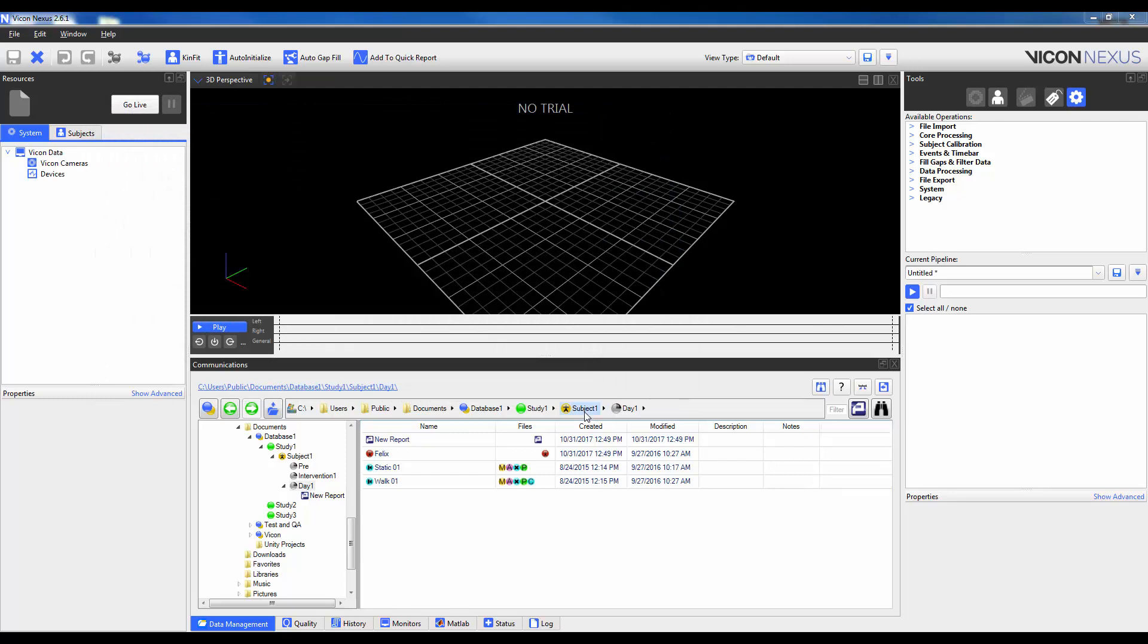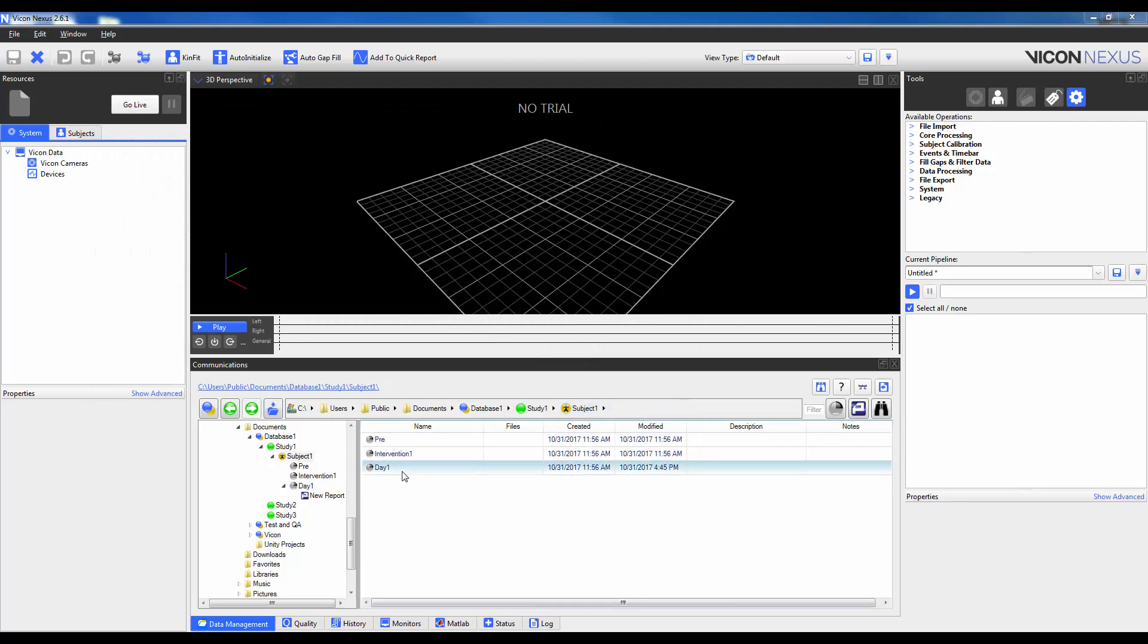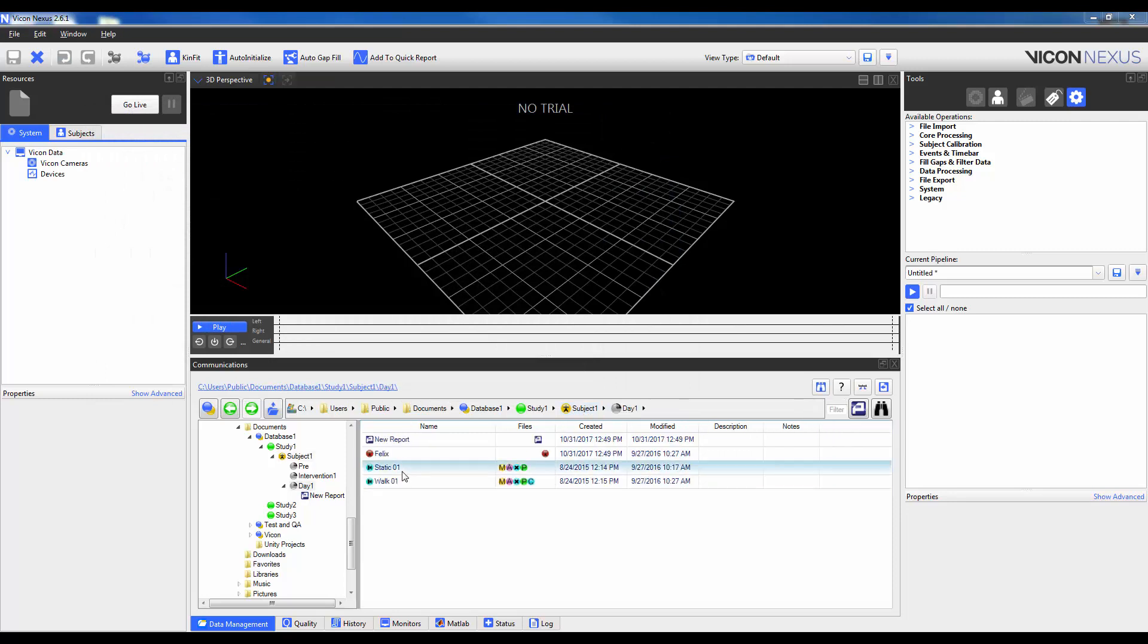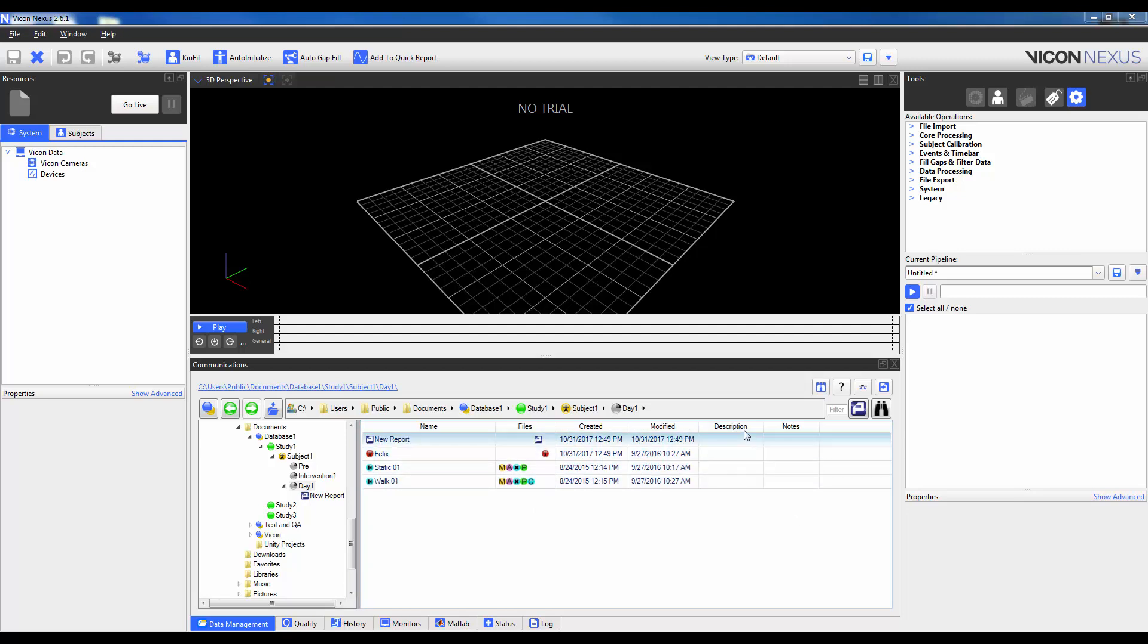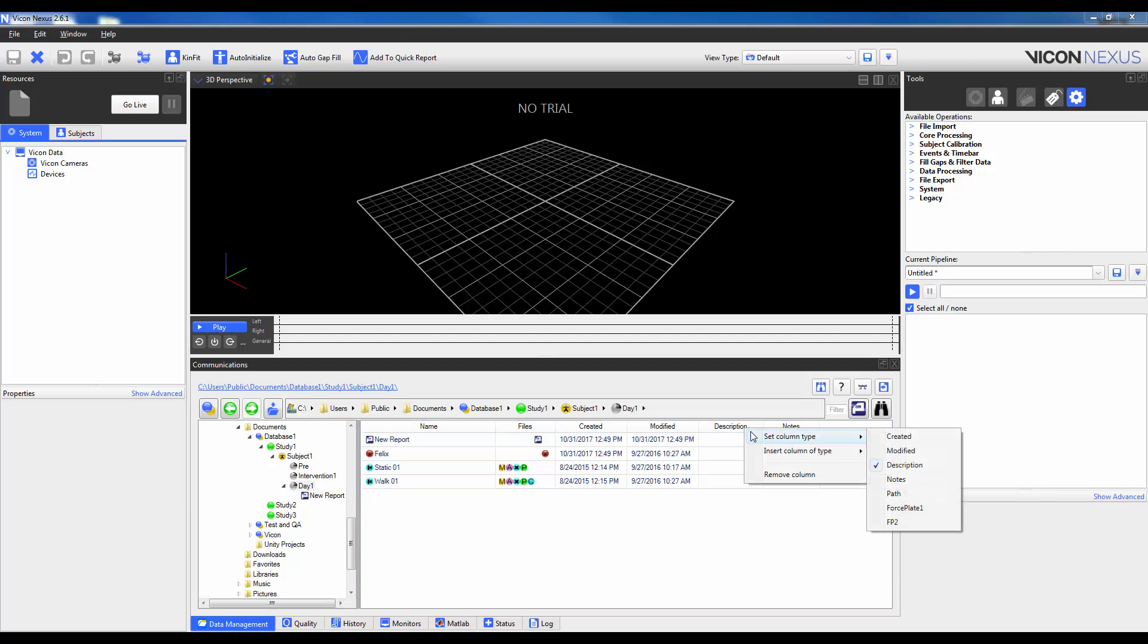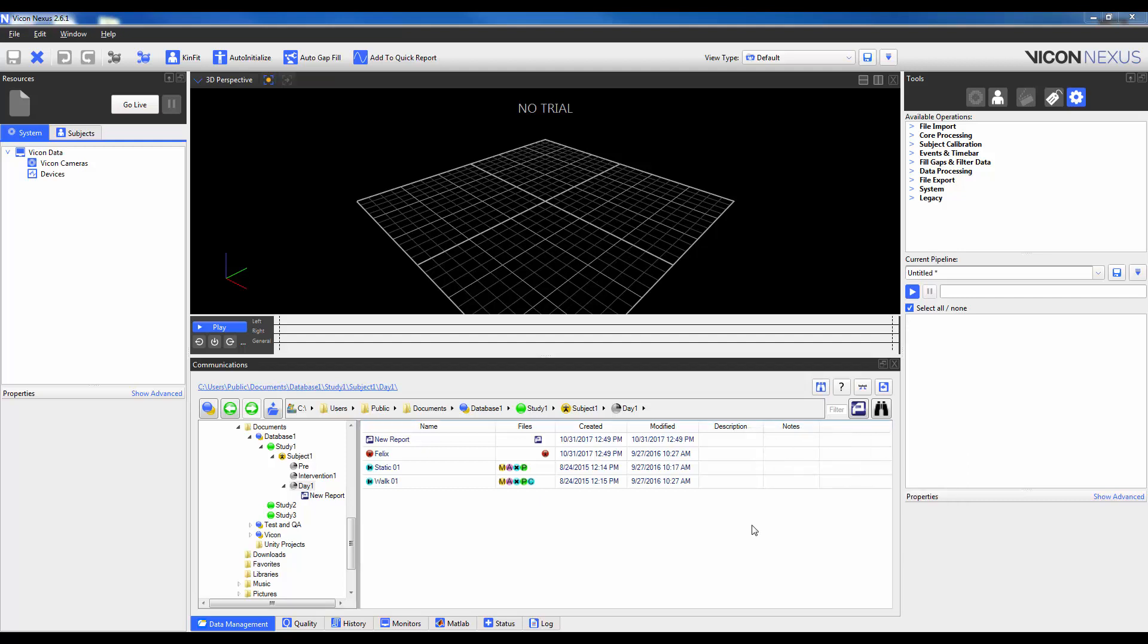So I'm going to close this, and then navigate to a session which I want to modify. We can see here that the layout of this Column Scheme is different than the one that had default. If I want to right-click on a header, I can see that I can set a Column Type, I can insert a Column after this Column, or I can choose to remove this Column.